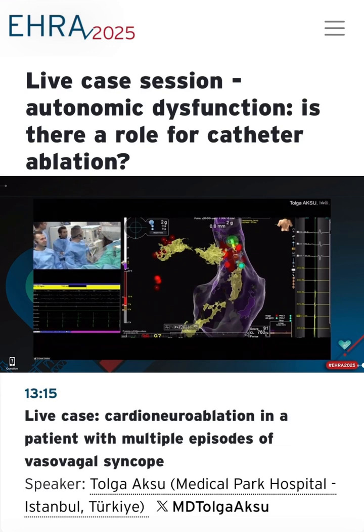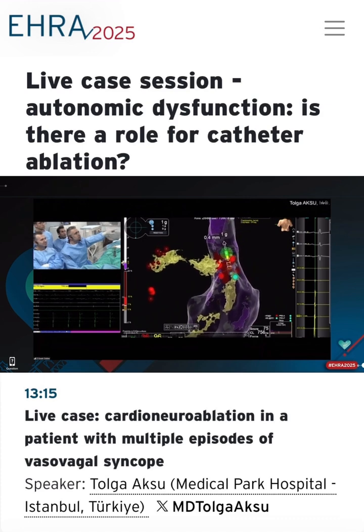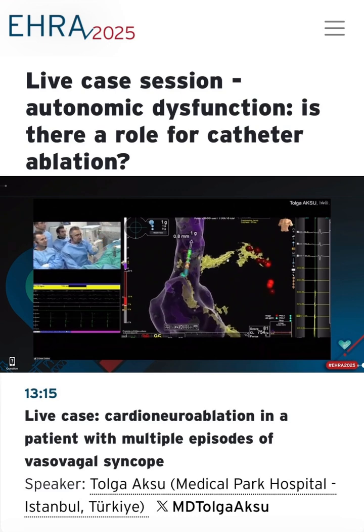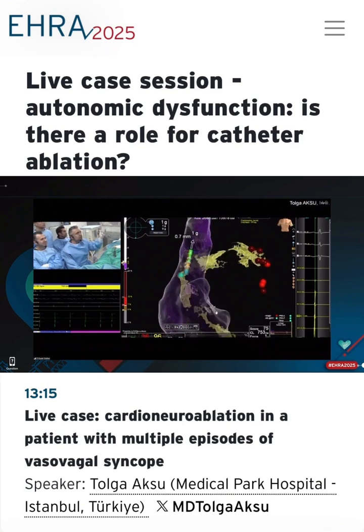Now we wait just for you. Please, atropine. We will apply 2 milligrams of atropine to see whether there is any change in heart rate or AV PR interval or something like that. And you are seeing we ablated the left superior GP. Can you show with an arrow, please? Left superior GP site. Yes, this is the left superior GP. You are seeing it on the CT specimen as well. We also ablated the right superior GP via both left and right atrium, and by pullback of our ablation catheter, we also ablated the right inferior GP. Please see from the posterior anterior view.